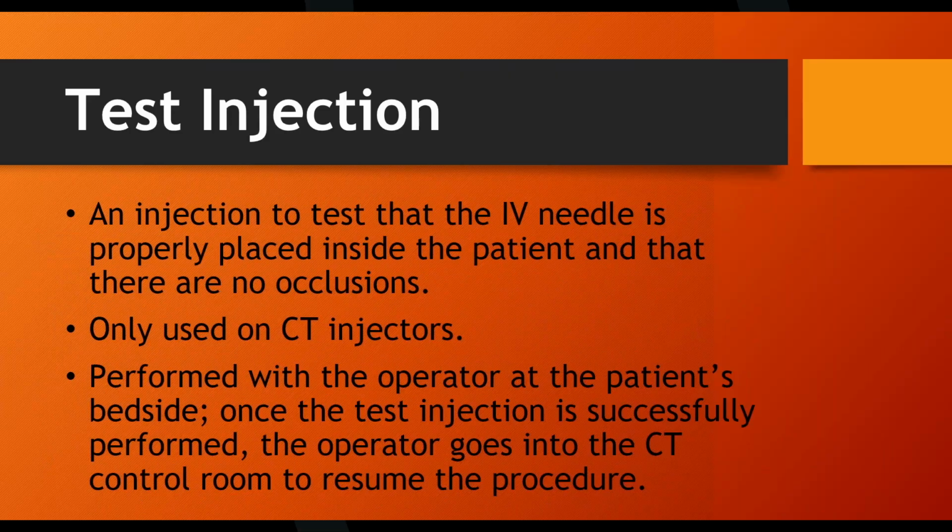So my first inject here, I'm going to set the system up. All right, so now when I hit the start switch, we're just going to do a test injection. It's going to be very, very low, very, very quick. So just watch. It's going to be the saline side. You won't be able to see this syringe move because it's going to be very, very little. So just watch this knob here turn, and that's it. That's the test injection.